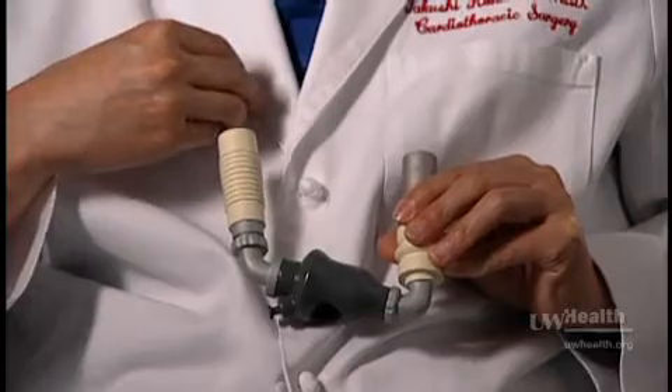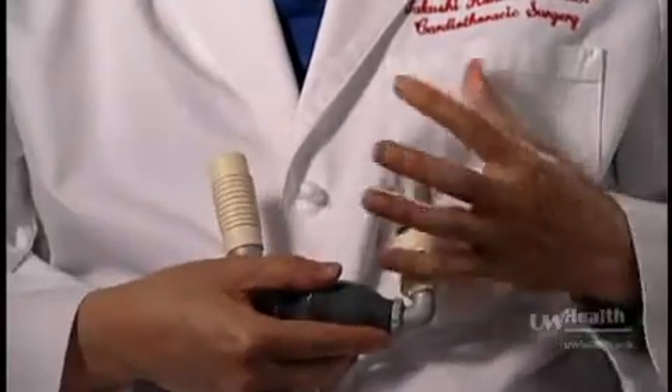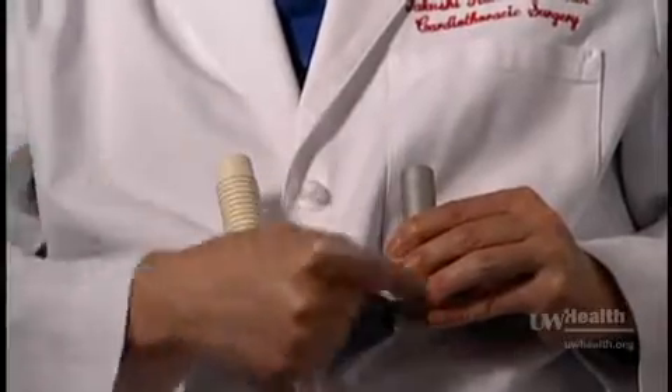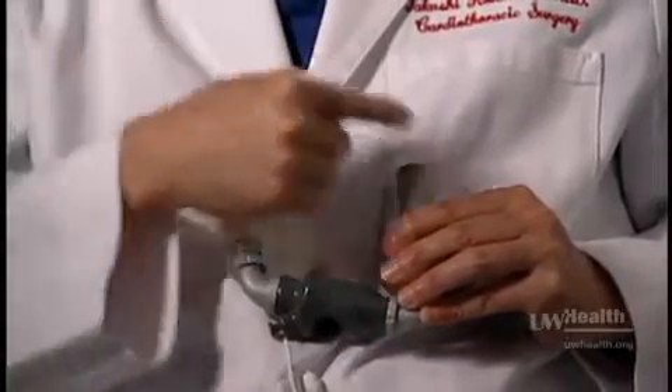the aorta, which is the biggest artery in the chest. So instead of the patient's heart beating, this device will pump the blood into the body like this.